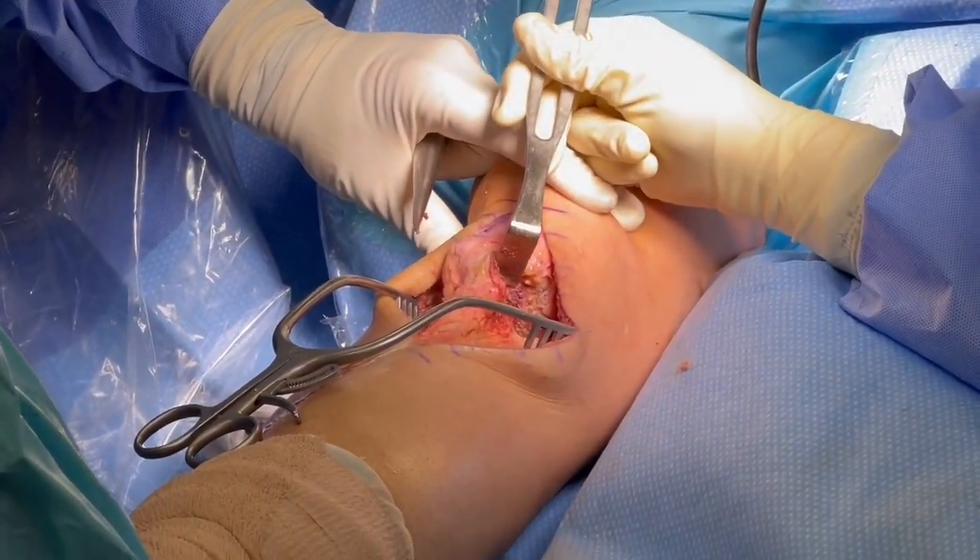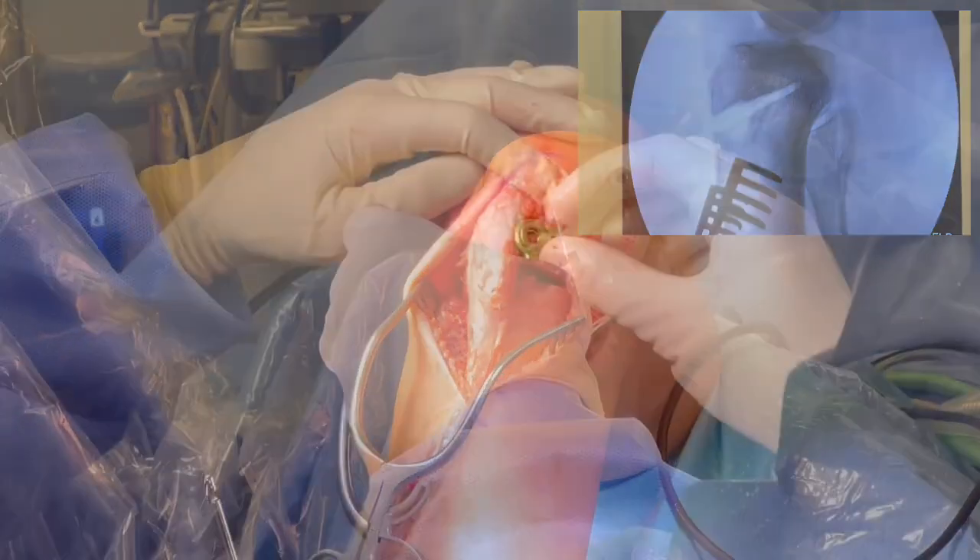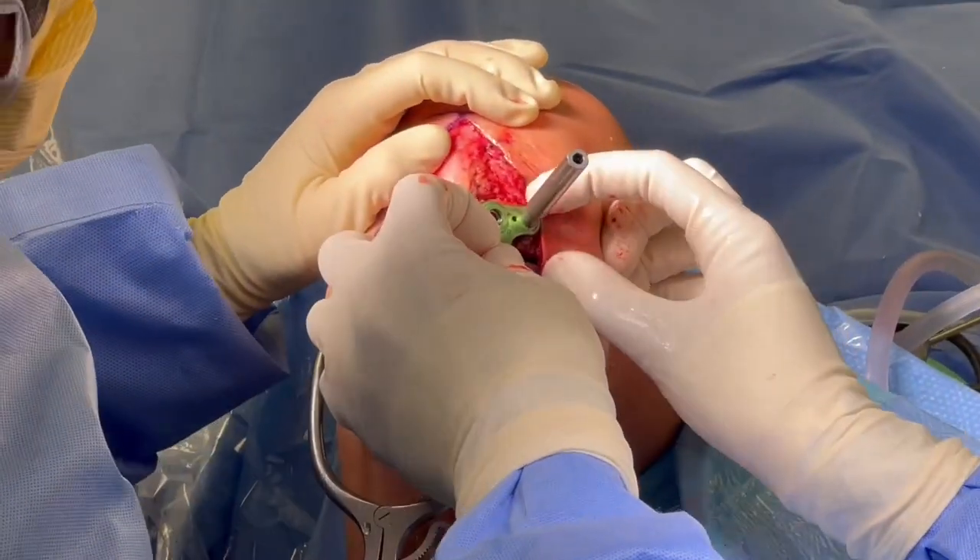We're going to full extension. You can see that after a while, when you continue to work this, you can compress this without any fracture, and then you're going to use a plate.